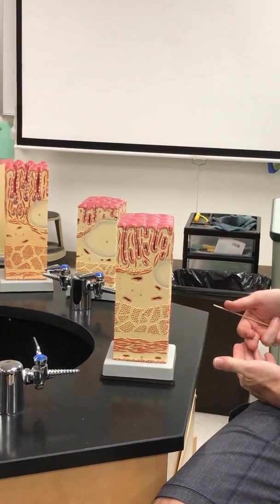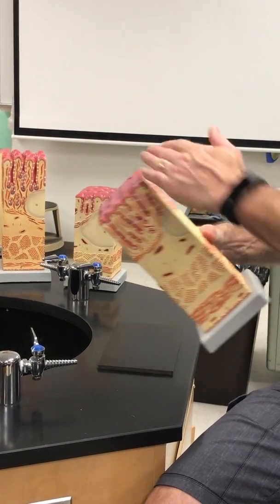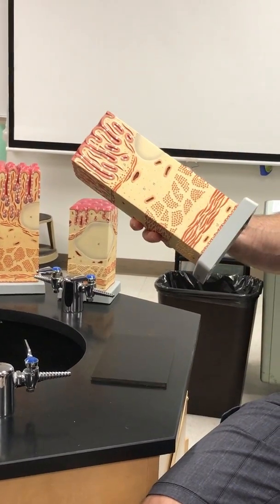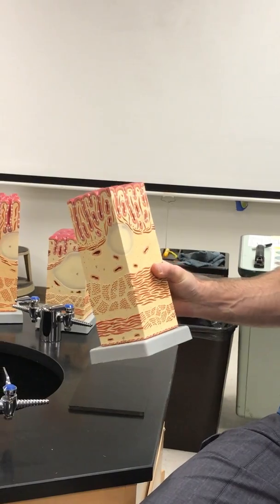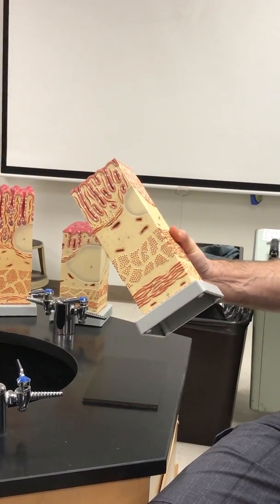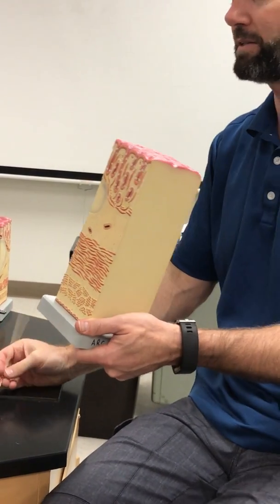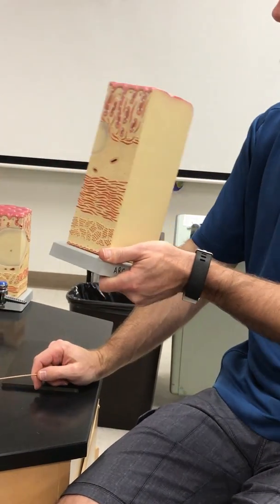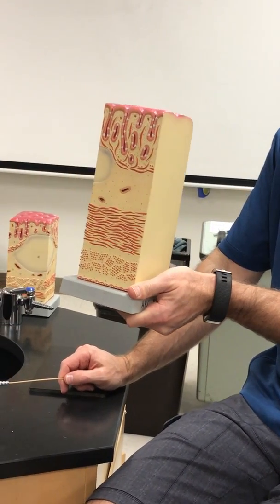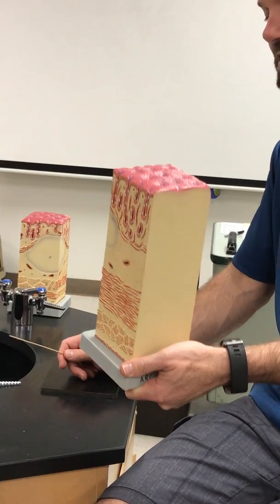So we narrow the focus here. Is it stomach? Is it small intestine? Is it large? Flat. So we could rule out small intestine because it's going to have villi. So maybe stomach or maybe colon. So what can we look for to figure out if it's stomach? Muscularis externa. There's only two. So it's not stomach, it's not small intestines, and it's not esophagus. Large intestine.